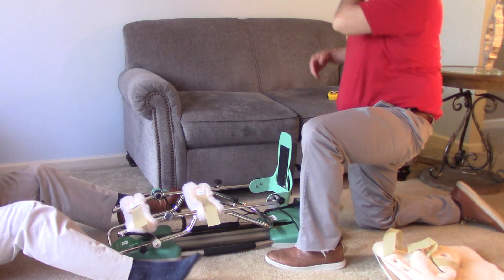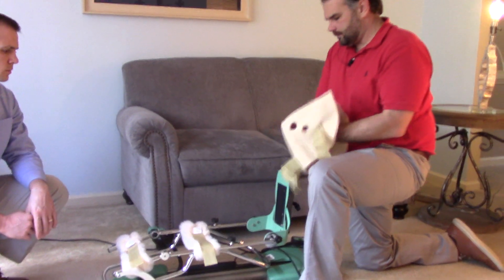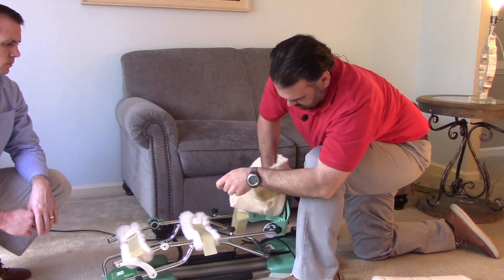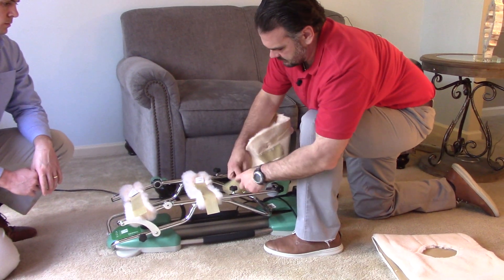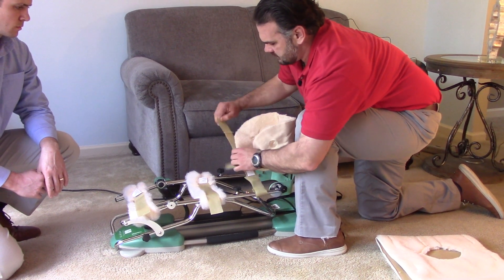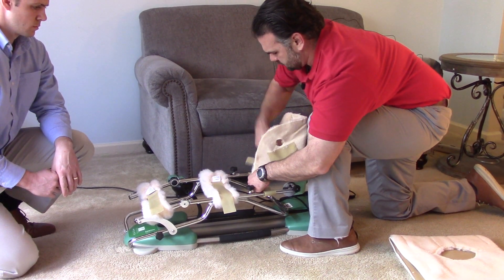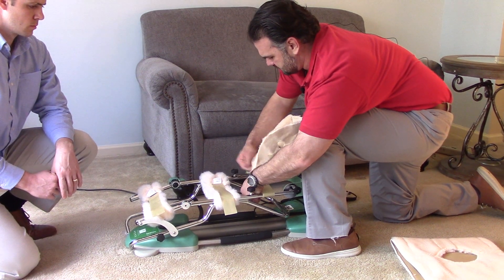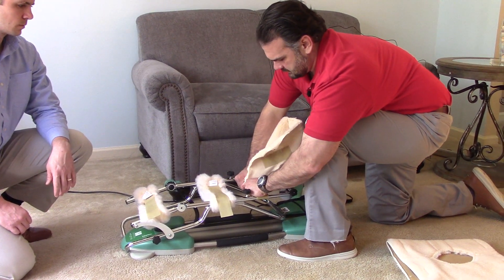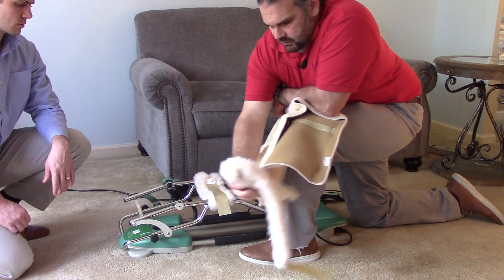Now Russ can jump out, and we'll get the rest of the pad kit set up for you. This is the foot wrap — it's got a little lip here, it just fits here. There's a Velcro base, it fits on the back of the foot pedal. These are just Velcro straps and they are going to wrap around the frame and to itself. You want this to be in the middle, so you can't make it too tight until you find exactly where you are. This leg strap will go back on, but for now we're going to take that off and set it to the side.